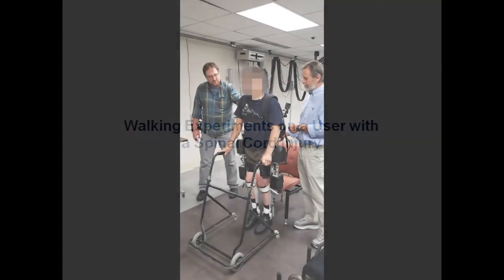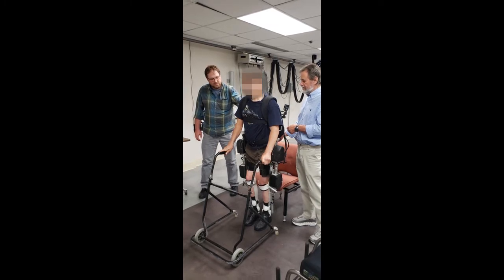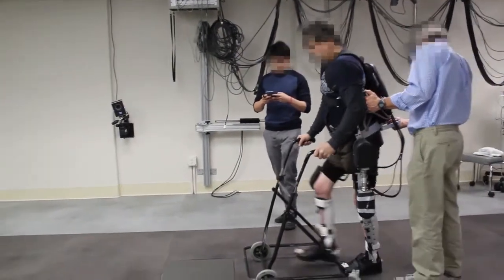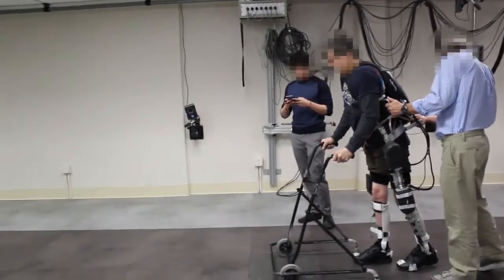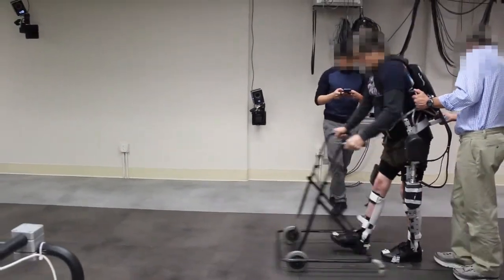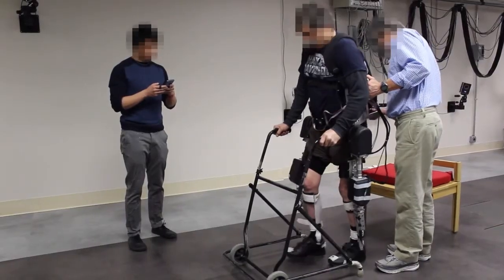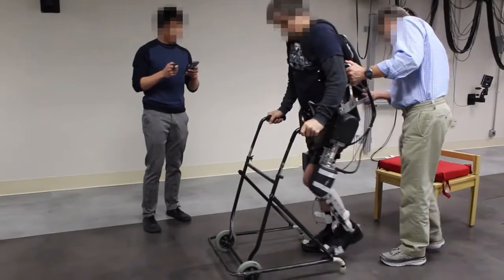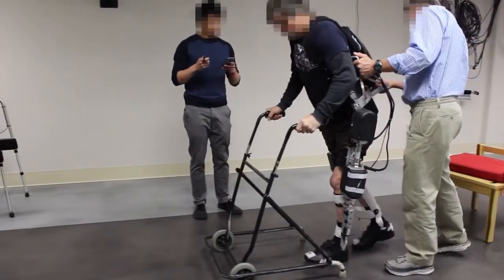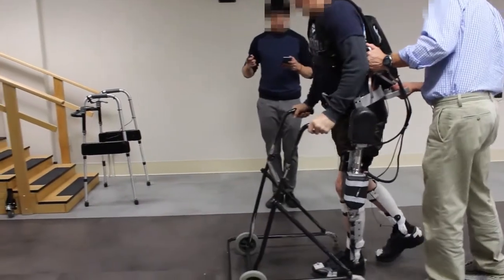We've also tested the CPWS with a participant with a spinal cord injury in a walking experiment. Shown here, the muscles are activated via neural stimulation in a typical walking pattern, while the electric motors provide ballistic assistance with timed bursts at various phases of the gait cycle to help complete the motion. The controller also compensated for friction to help make the device feel more invisible to the user.